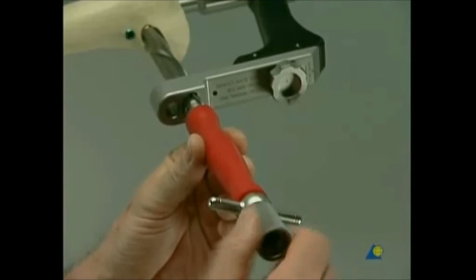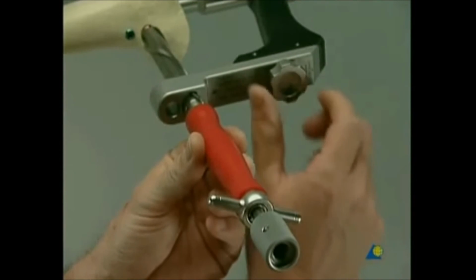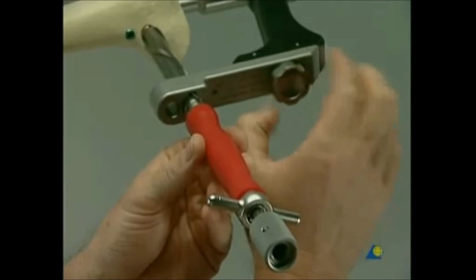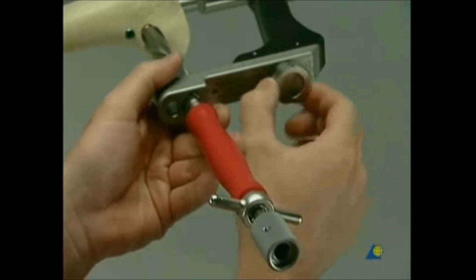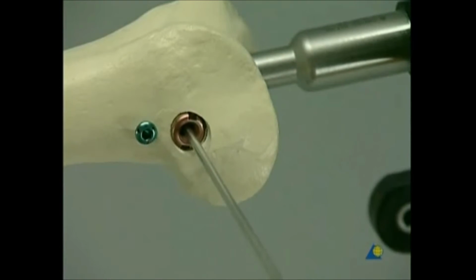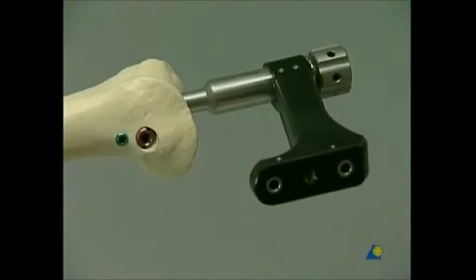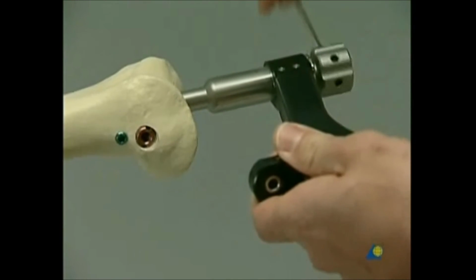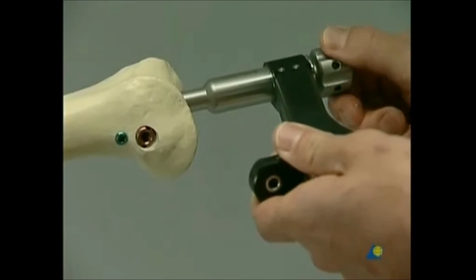The connecting screws for the spiral blade and the aiming arm are loosened, and the inserter and the aiming arm are removed, as is the guide wire. Then the proximal locking follows, although it's not shown in this practical exercise. The connecting screw between the aiming arm and the nail is loosened and removed together with the insertion handle.